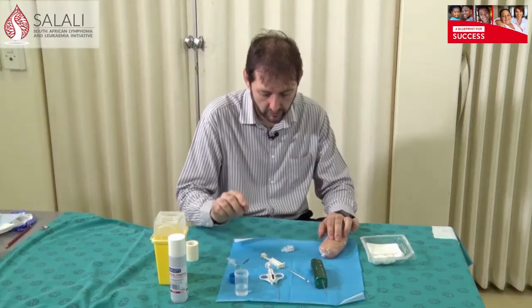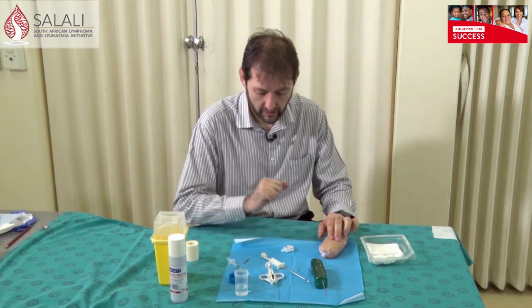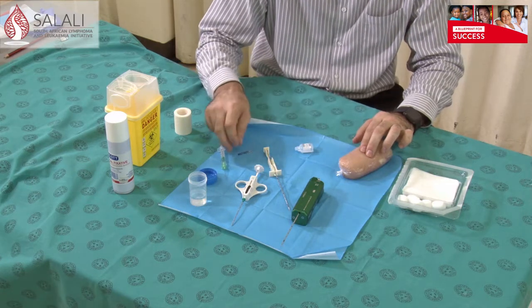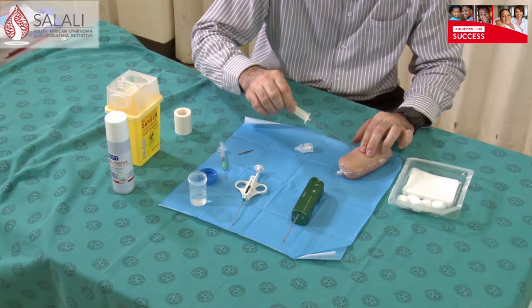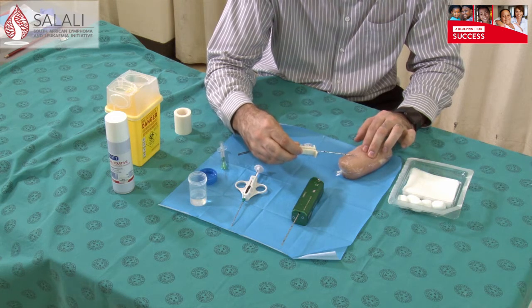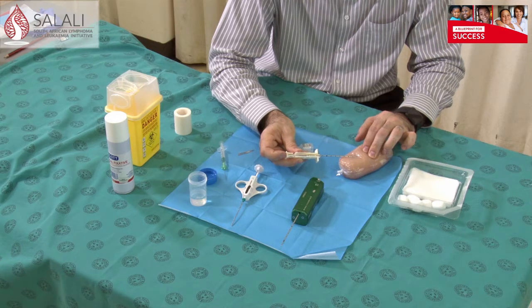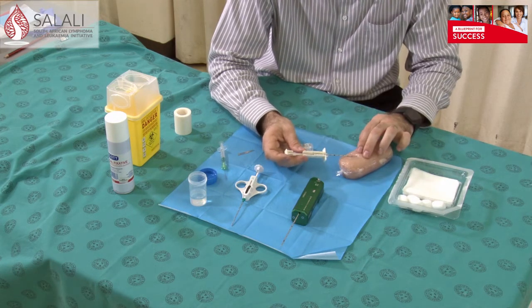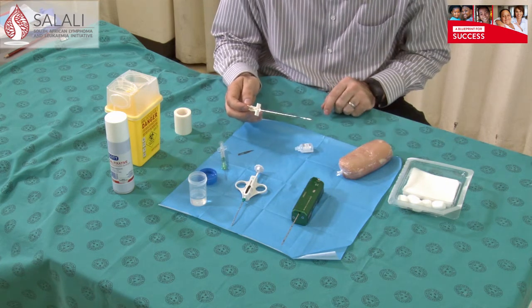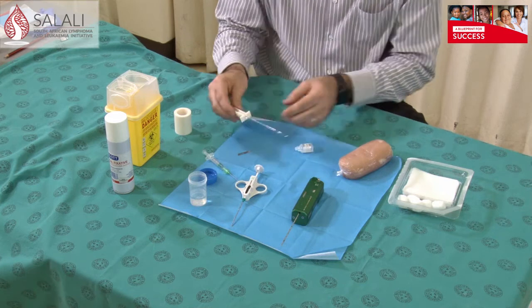Inject the area you're going to use to get to the lump you're going to biopsy. Once you're happy with that, wait a couple of minutes for the local anesthetic to work. You can make a small stab through the skin just to give your needle ease of access. Go through the skin with your manual needle just in front of the lesion, push your biopsy stylet forward, close the biopsy specimen port, take it out, open it up, and inside you will find your biopsy specimen.